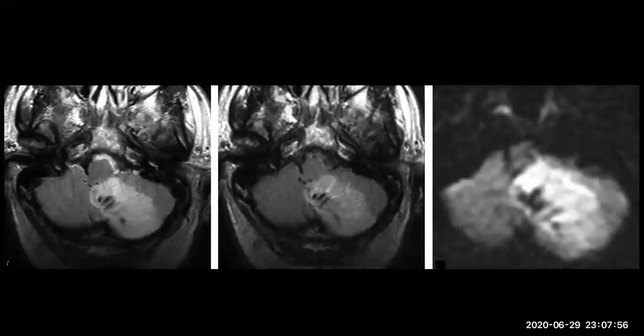Multiple axial views for the MRI brain, lower cuts showing the cerebellum. There is an ill-defined left cerebellar hemisphere mass lesion, which shows high signal intensity on T2 and FLAIR, and showing diffusion restriction. The corresponding left cerebellar hemisphere, I think, appears a little bit dysplastic. There are maybe at least three or four hypointensities seen within, maybe signal voids. Hemorrhage, maybe, I'm not sure.